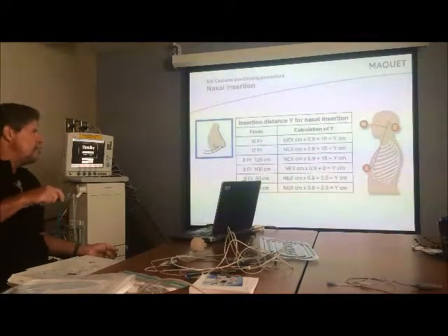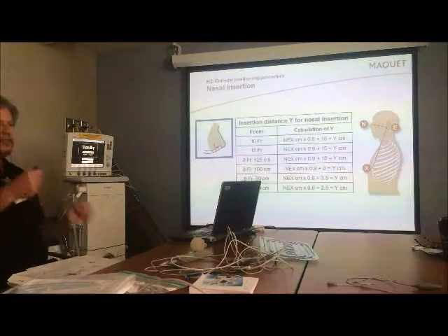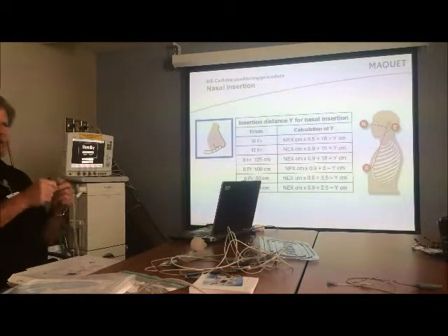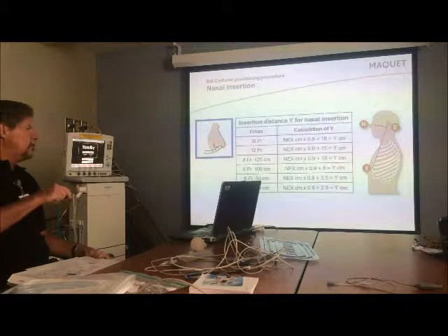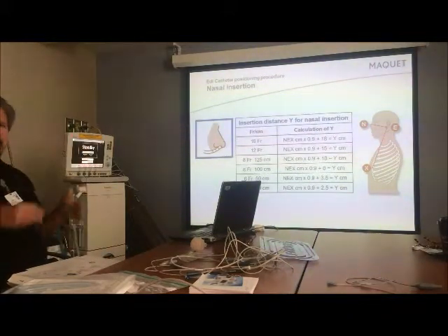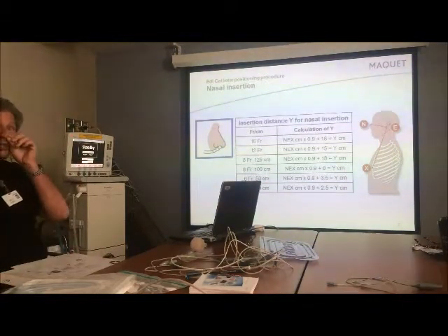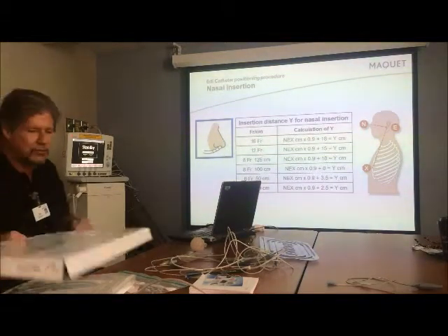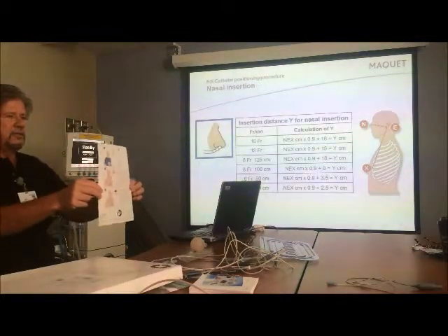So you can see that after a while with babies, if you do it enough, you might say, just put it in to the NEX measurement and we'll look at the ventilator and make an adjustment, rather than getting our calculators out and doing the measurement. But initially, it's a good idea to do it as if you first got out of school and you've got your teachers looking over your shoulders, making sure you're doing it right. And that's what the nurses did initially, but then after a while the nurses are just dropping catheters without even measuring, I'm sure.